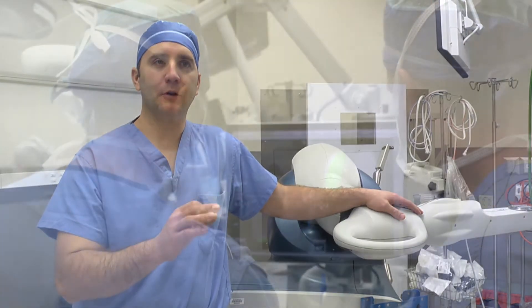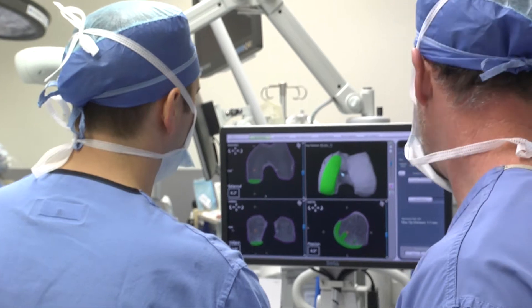The surgery is all about protecting the soft tissues. Whether it's the hip or the knee, the whole goal is to go in there, get rid of all the arthritis, put the new components in and do as little soft tissue damage as you can.